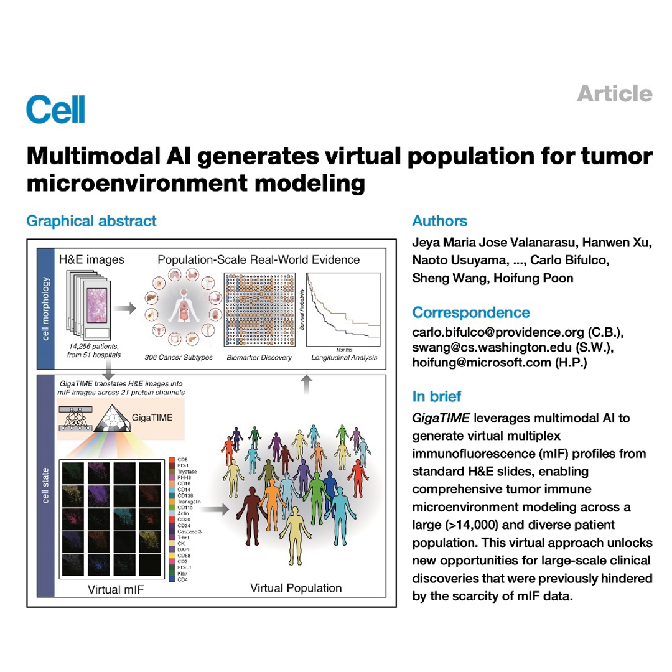Exactly. And finally, you have the slide level. This uses Spearman correlation, and it's inspired by a real clinical metric called the immunoscore. This is the big picture. This one checks if the overall pattern across the entire slide is correct. Right, the overall density and distribution, because that's what often matters for the clinical outcome. You really need all 3 to be right, shape, cell count, and global pattern, to trust the results.